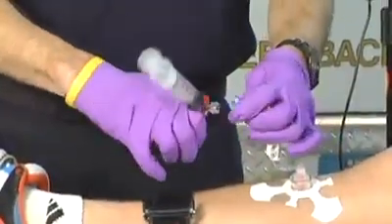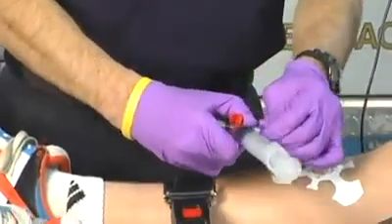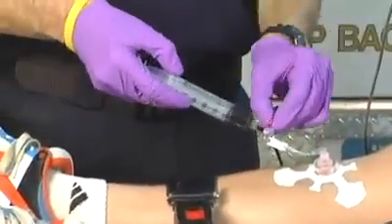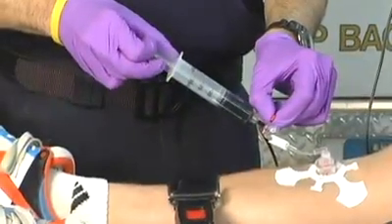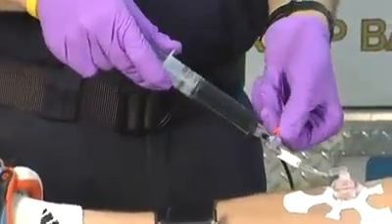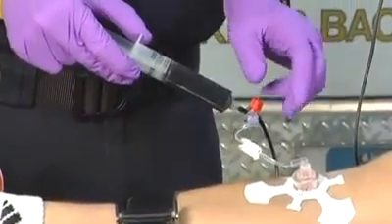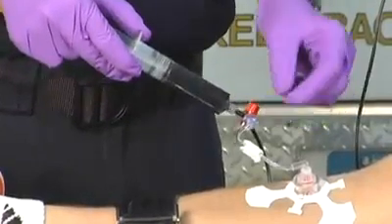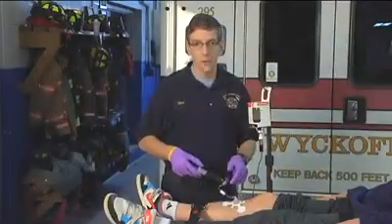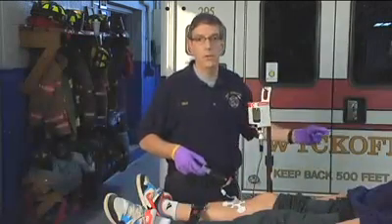We'll remove the syringe that was there and connect the stopcock to the intraosseous line. We're now in a position to pull medication into the syringe from the bottle of hydroxycobalamin — Cyanokit — hanging above, then turn the stopcock towards the patient and push the medication through the intraosseous line. You can continually turn back, pull medication from the bottle, turn back to the patient, push medication into the patient, and deliver it over seven and a half minutes, then use the same tubing to spike the second bottle of hydroxycobalamin.